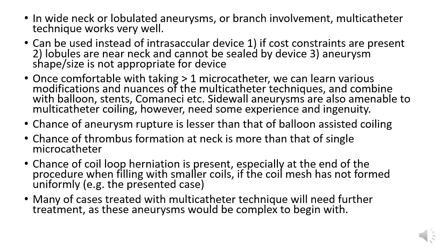Chance of thrombus formation, however, is more as you fill more coils at the neck. Some of them can hang down because of the wide neck, and so thrombus does form occasionally, but most of them are resolvable by some type of infusion or some more heparinization, etc. Most of these patients will not need aspirin for that.